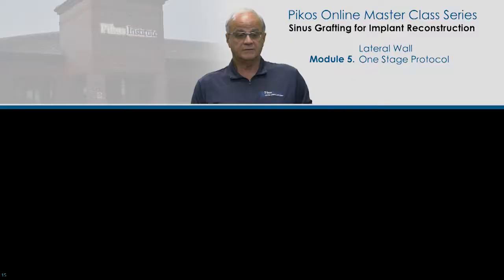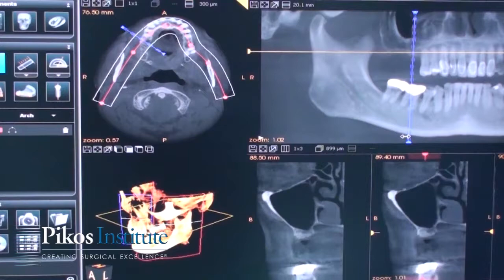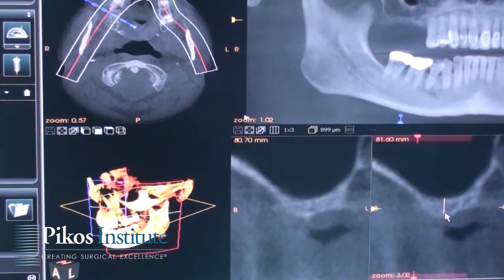Let's look at this video that gives us a good idea of how this protocol works. Looking at this particular distal extension site, we're missing molars. The game plan is to place two implants and do our lateral wall graft at the same time. There's a variation in residual alveolar bone height from maybe three to four millimeters up to six or seven, and that's fine.